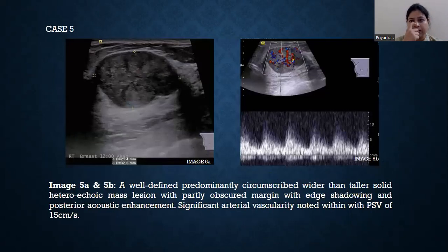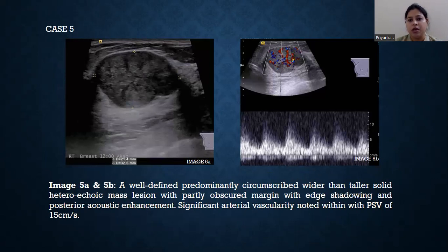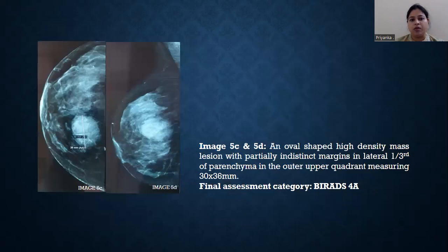Case number 5: a well-defined, predominantly circumscribed, wider than taller, solid, hypoechoic mass lesion with partly obscured margin, edge shadowing, and posterior acoustic enhancement. Significant vascularity on limited color Doppler.